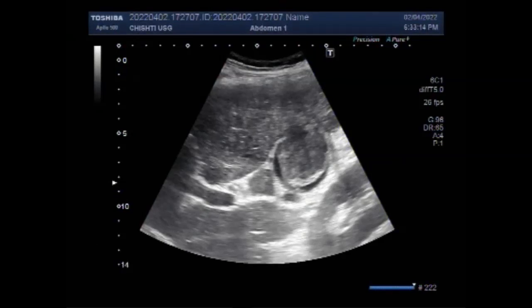Dear viewers, I hope you are all fine. This small ultrasound video shows a case of gall bladder mass.